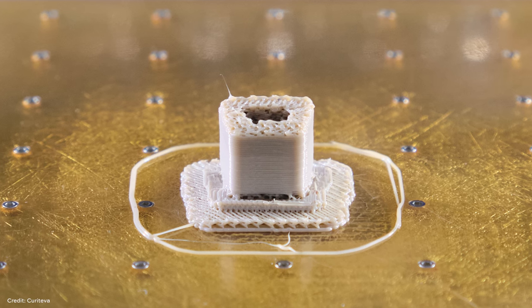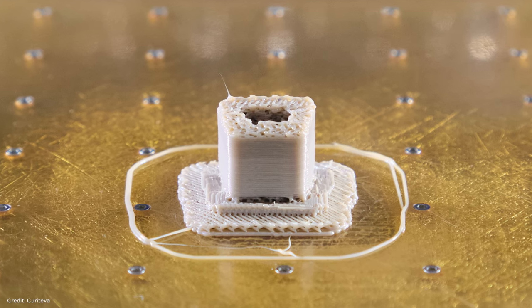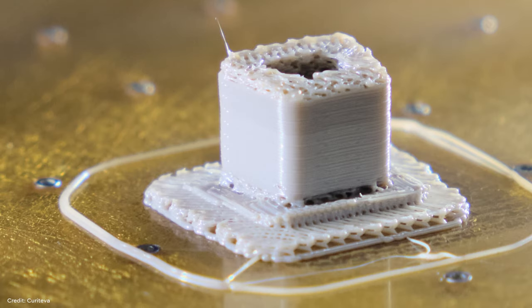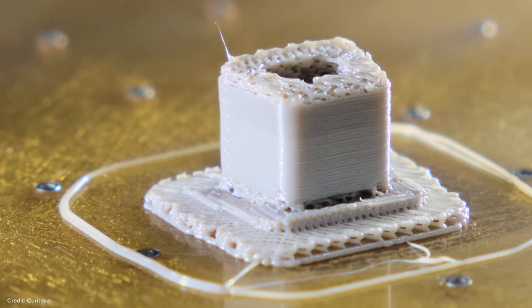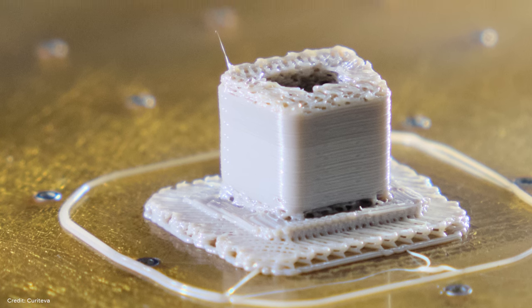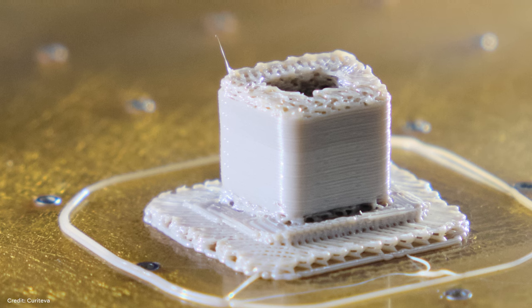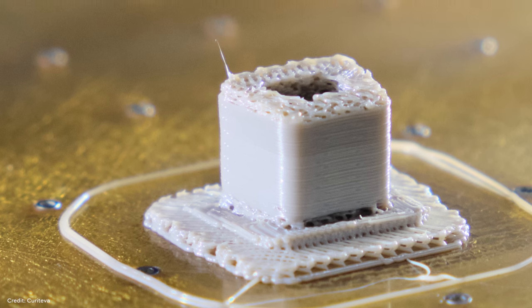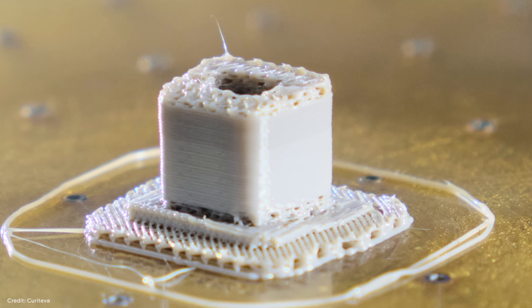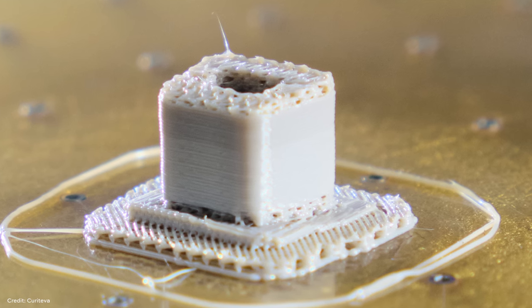And you may hear in the literature about Z-layer bonding. As you can imagine, a 3D printed part has an X and Y layer in the two-dimensional plane. But as you build that three-dimensional part, that's the Z-layer. And if those subsequent layers, any one of them could be a site for a defect or a delamination. So the critical control of that deposition in fused filament fabrication is really where we get a leg up in controlling our final structure property relationships.